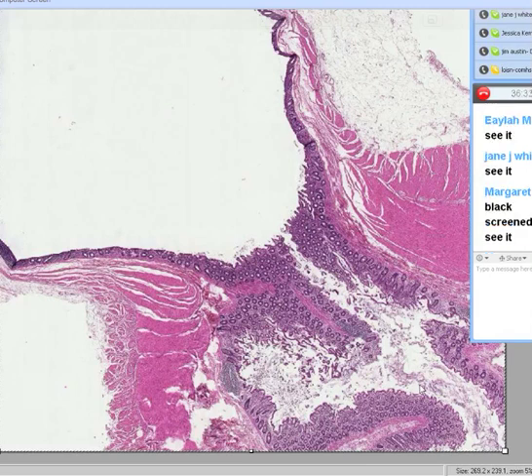I think you will all agree again that this is a gastrointestinal organ. I think you could tell that the stuff here, superficial to the mucosa in the lumen, goes by the medical term caca. And then you could see the actual mucosa, and it's not a papillary type of mucosa like the villi of the small intestine. So once again, you know it's a large intestine. And you can see that here's the mucosa. Here's a little Peyer's patch down here. And then you can see a little bit of submucosa here.